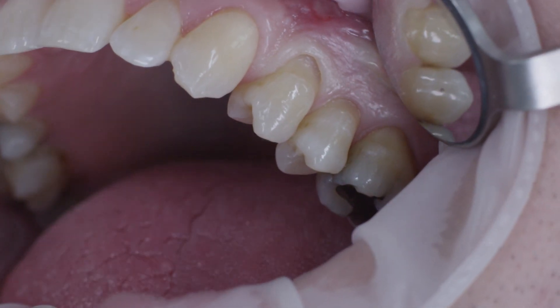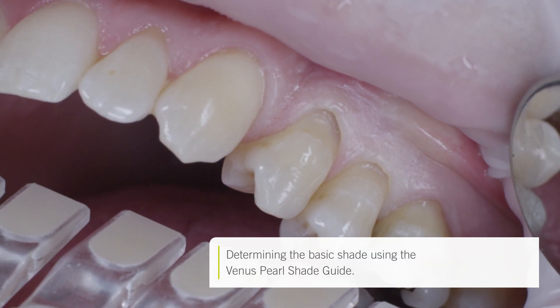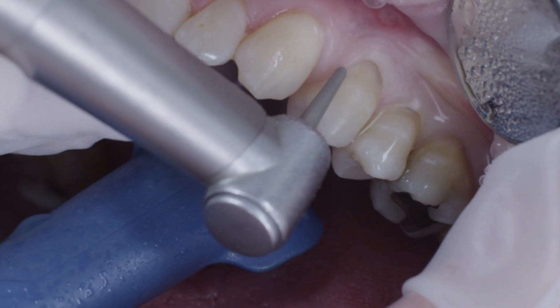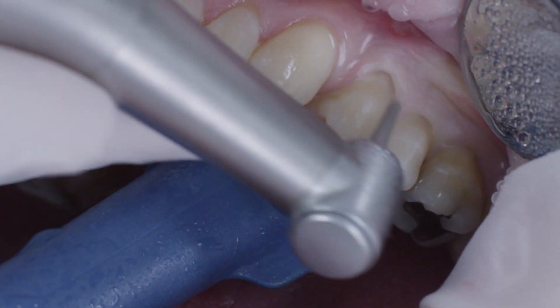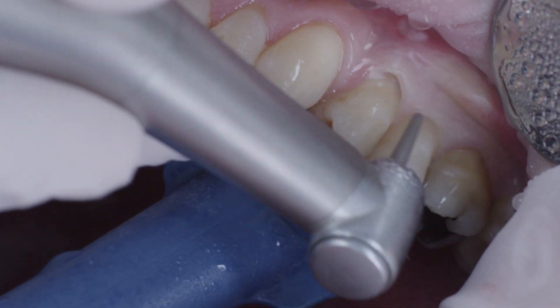I used the Venus Pearl shade guide for shade selection and chose A3 as the basic shade in this case. In order to improve adhesion as well as the optical characteristics in the transition area of the composite and tooth substance, I used a fine-grained diamond tool to prepare the enamel.